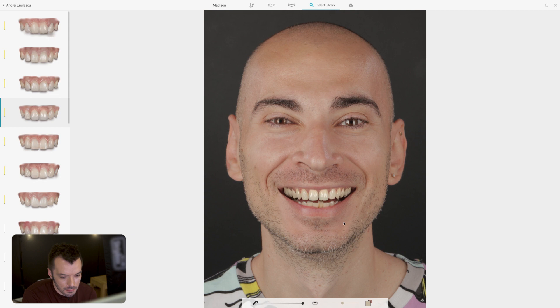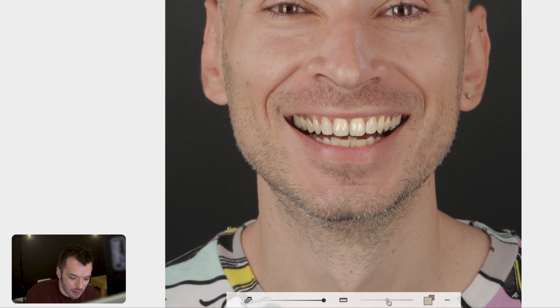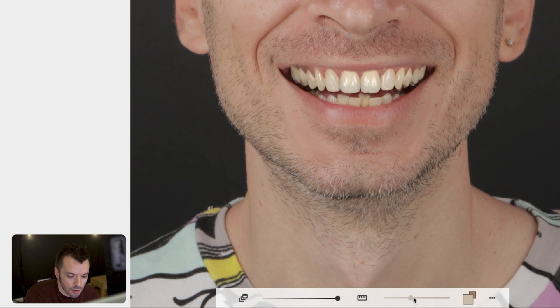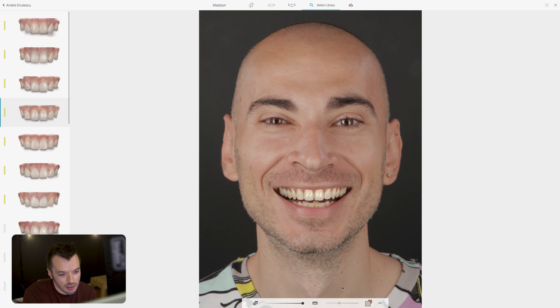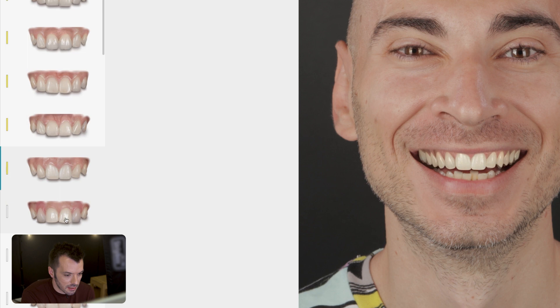This is a very nice feature for getting a photorealistic result. In terms of color, there is one single color bar. As you move it one way, chroma goes up and value goes down — that's an older appearance. Moving it the other way, chroma goes down and value goes up — that's a younger appearance. Feel free to play, as the colors generated are quite realistic and adapted to the existing lighting in the picture.